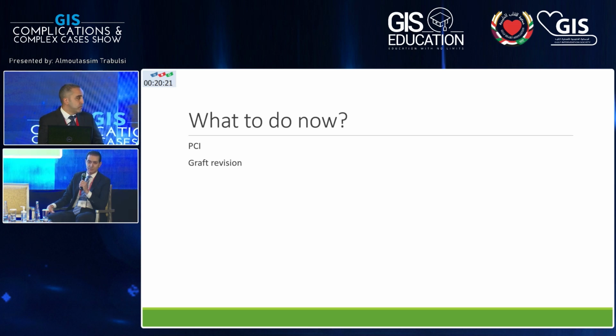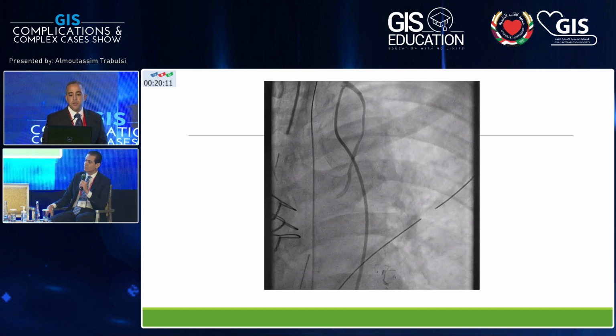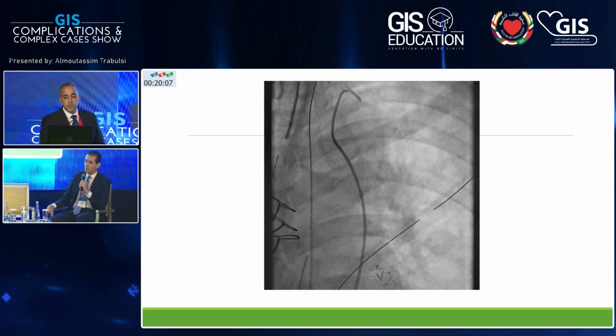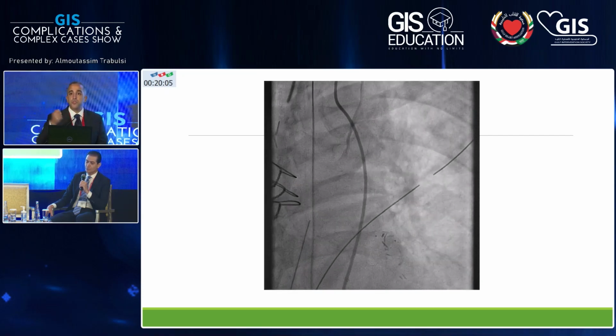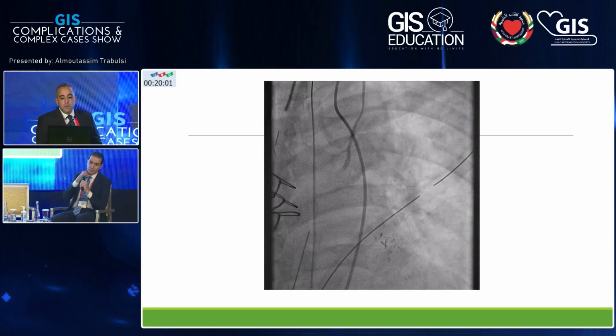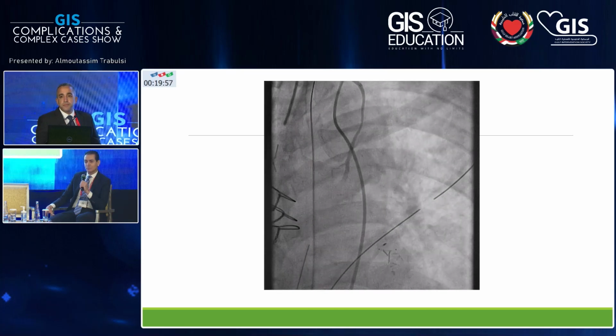I can't fully understand what's going on with the left internal mammary artery, but I'm still processing. Yeah, it appears there might be even a thermal injury, even the proximal segment of that. I don't know, you're a surgeon probably, but there might be some issues in the proximal segment of that LIMA. It could be just some thermal injury as they're dissecting or closing the small, I don't know. Yes. Yes, I mean, it's hard to comment, but there's obviously something quite badly wrong.